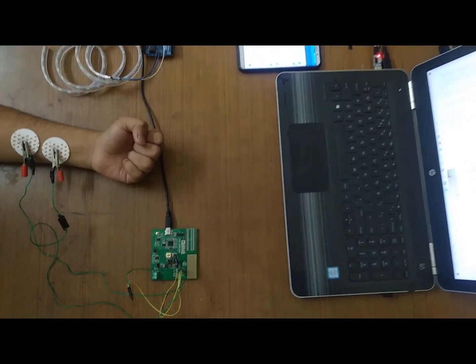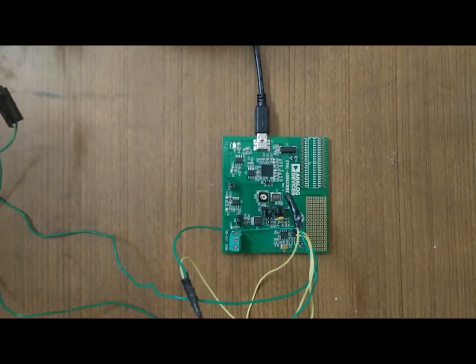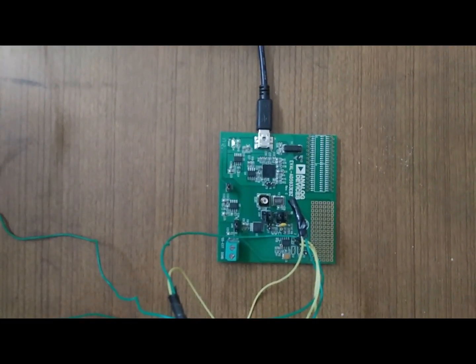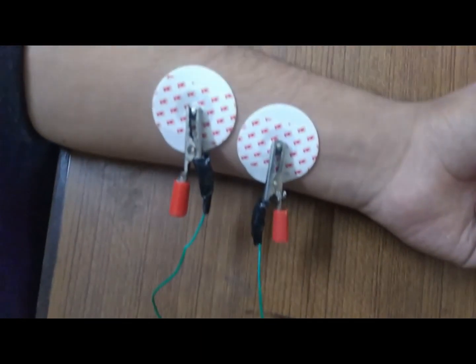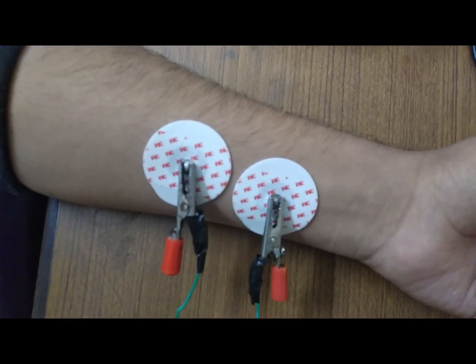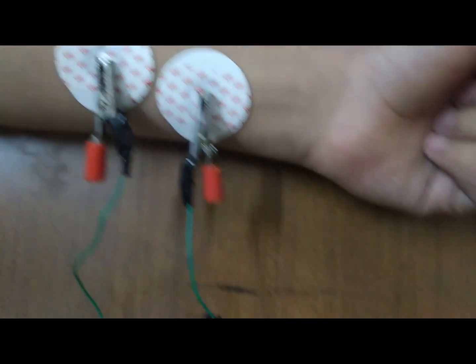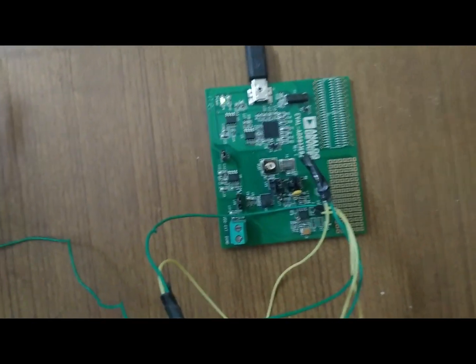Coming to the hardware part. This is AD5933 impedance analyzer. The excitation signal from the impedance analyzer is given to the left electrode pad. The response signal from the right electrode pad is given back to the impedance analyzer. The values of the analyzer can be seen on screen as a graph.